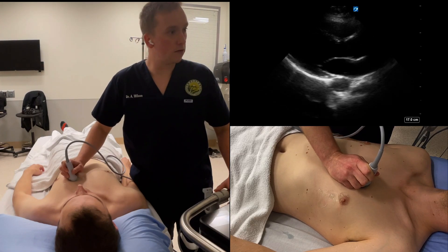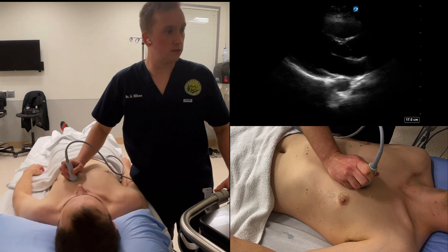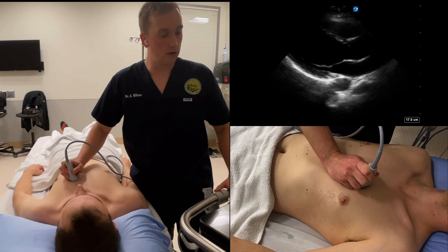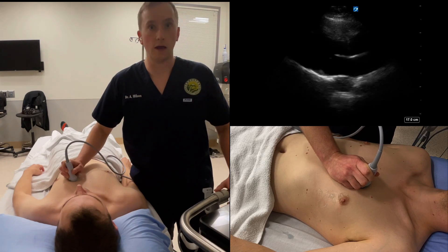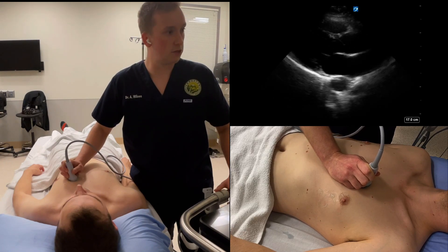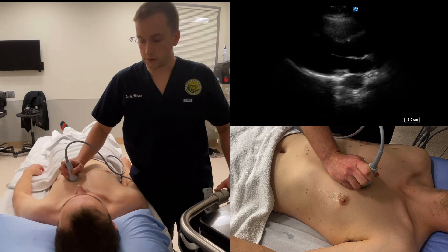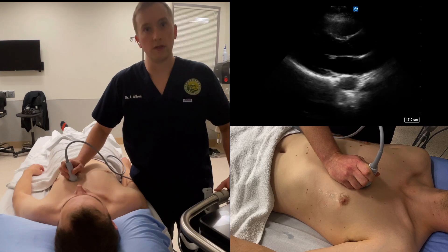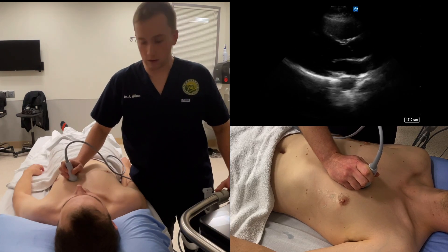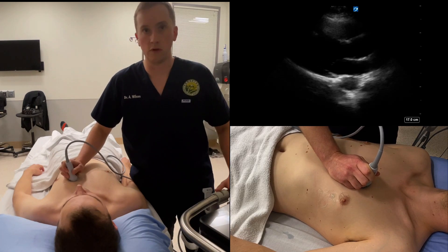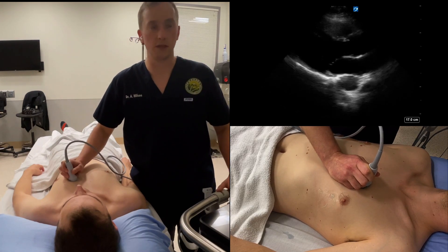If you're having difficulty obtaining this view, you can try getting the patient to turn into the left lateral decubitus position. You can also try moving up or down in interspace, and generally moving closer to the sternum will improve your chances of success.